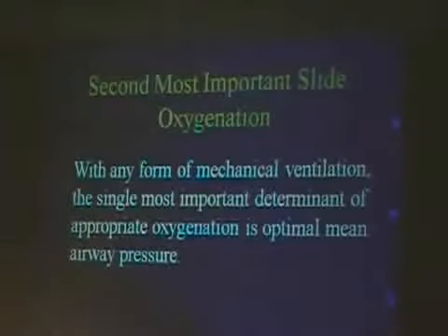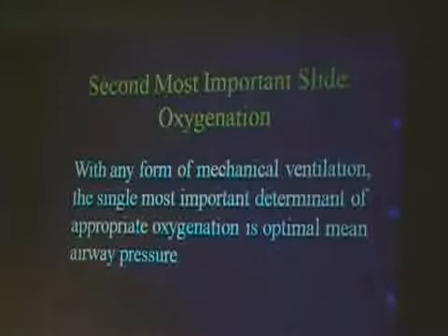All right, second most important slide. We're going to talk about oxygenation and ventilation throughout these series of 3 talks, because obviously those are the 2 most important things that we're trying to do.